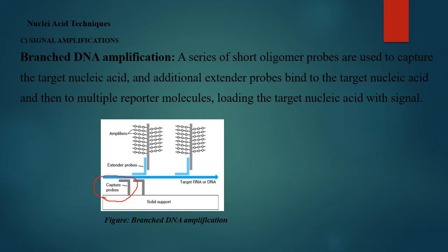Then additional extender probes. These are the extender probes. They bind to the target nucleic acid. So capture probes bind, extender probes also come to bind.